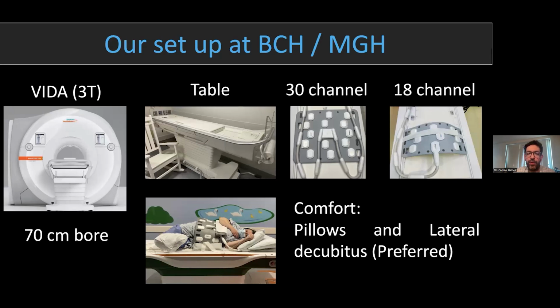So we definitely support their head, we support their arm, and we also put pillows between their legs. Turns out that every investment you make in maternal comfort will come back as a tremendous investment. The last thing is you have two options. I think either one of those would work.